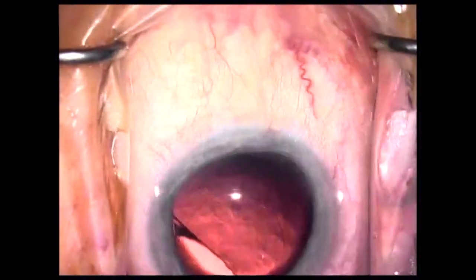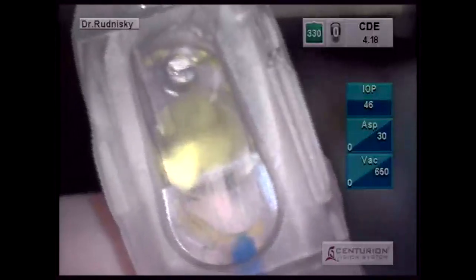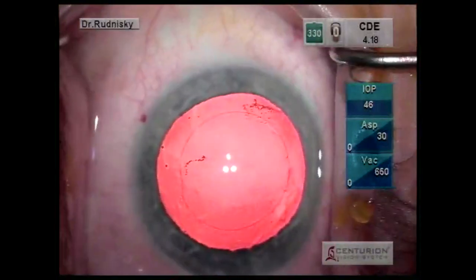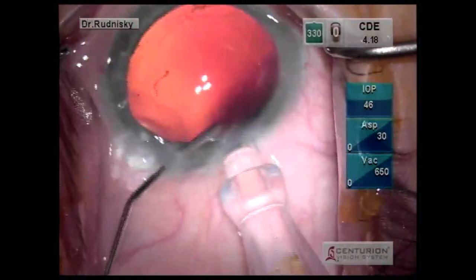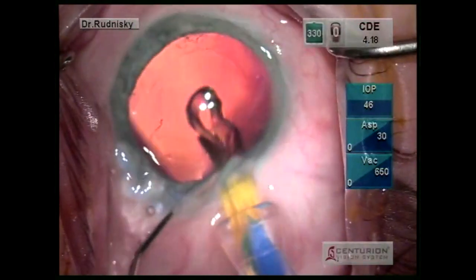I think I've come up with a solution to this that works in most cases. The first step is just to engage the trailing haptic — I don't push the optic at all, and I think this allows for a little bit more gentle insertion. I first insert the auto cartridge and then I use my Helon cannula as counter traction, which is really helpful because you have to apply quite a bit of pressure with the auto lens.